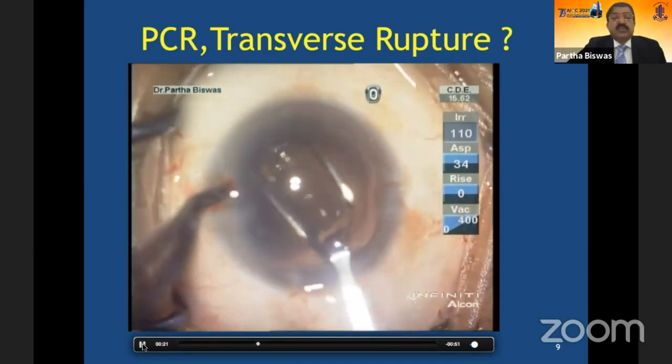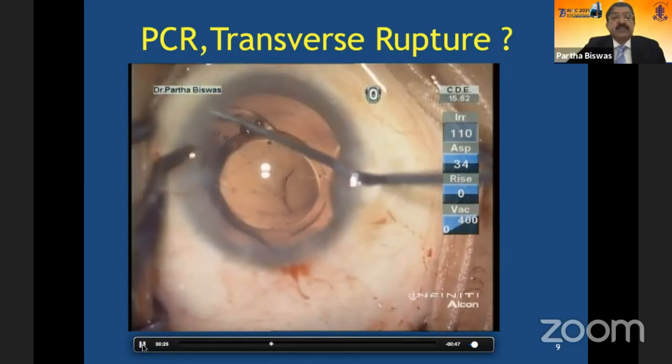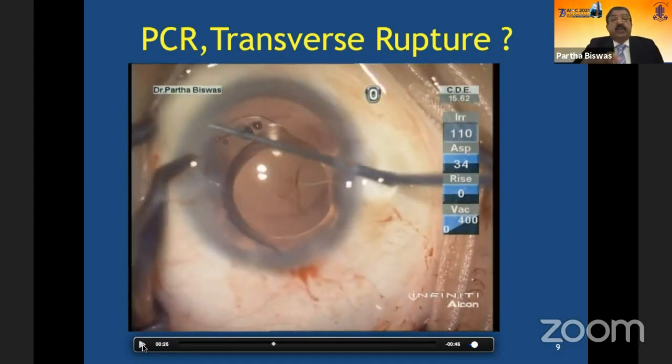So there's a small trick and a little bit of a technique. I'm going to show you this, demonstrate it. Now, this is important. So what I did is, with viscoelastic cover, I placed this intraocular lens just there, and an adequate amount of viscoelastic over the intraocular lens as well. So it's stable now. But what I did is I injected the leading haptic over the iris. I did not venture to put it in the bag in the first place.